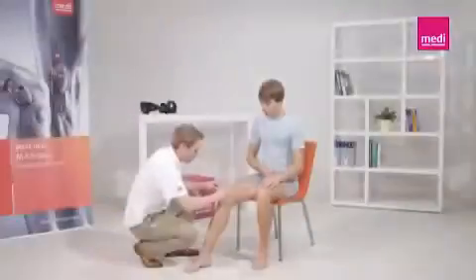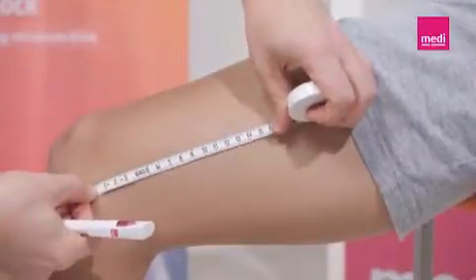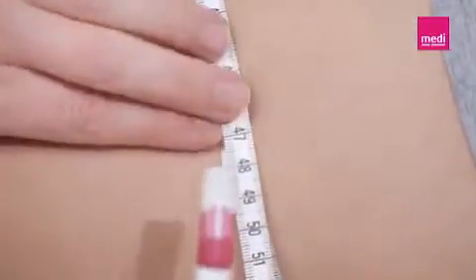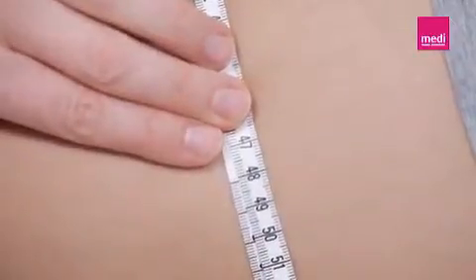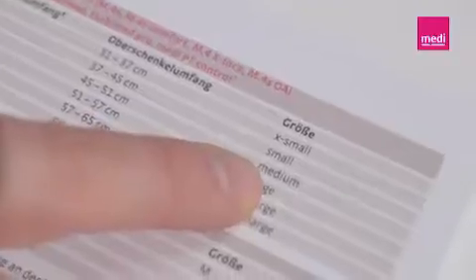To determine the correct size of the orthosis, please measure the circumference of the affected leg 15 centimeters above the middle of the knee joint on the medial side. You can then select the suitable product from the size chart.